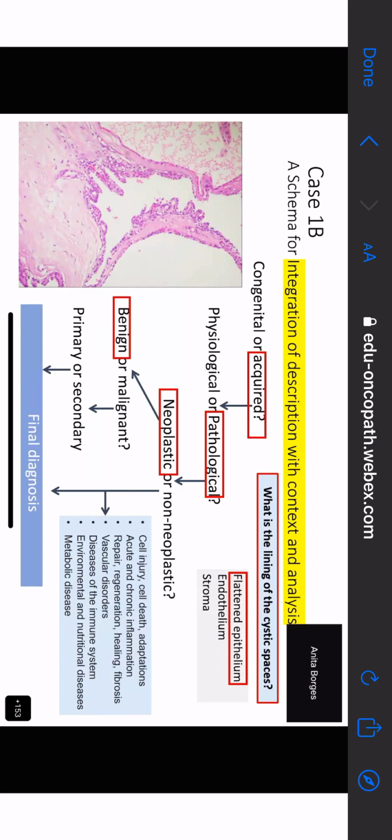And eosinophilic cytoplasm. Eosinophilic cytoplasm. Okay. Are you looking carefully? Yes, ma'am, and it is eosinophilic. You want to see these cells? What do they look like? It's all part of the same. They have a clear cytoplasm. Is that the only place that you can see the clear cytoplasm? Now look carefully. Many cells, it is clear.